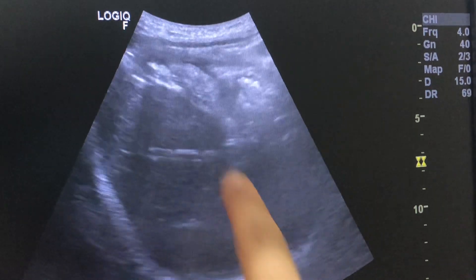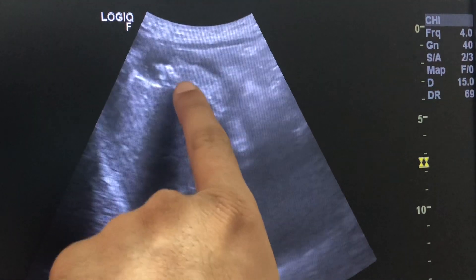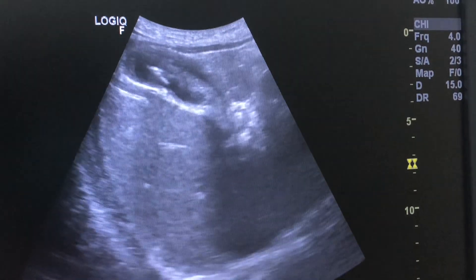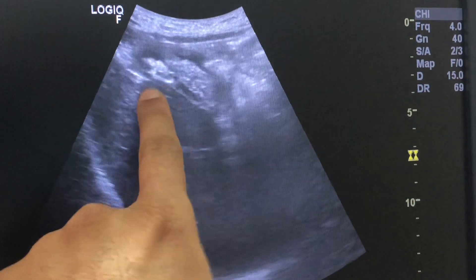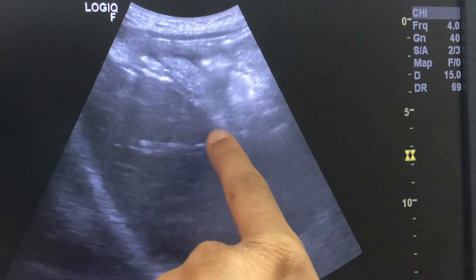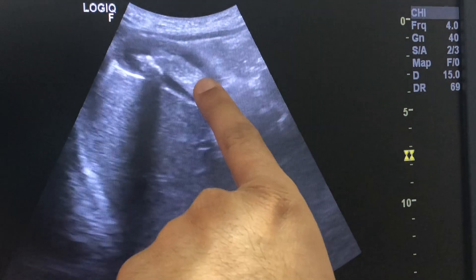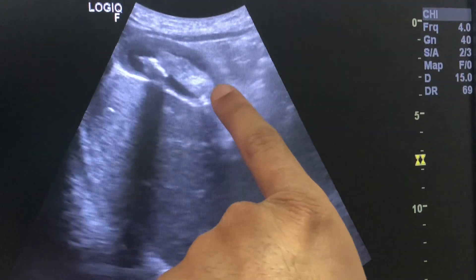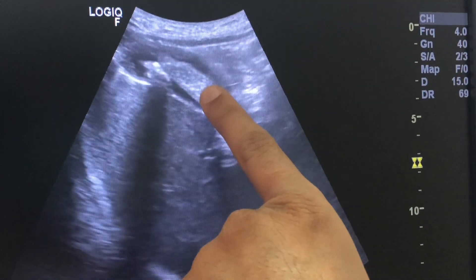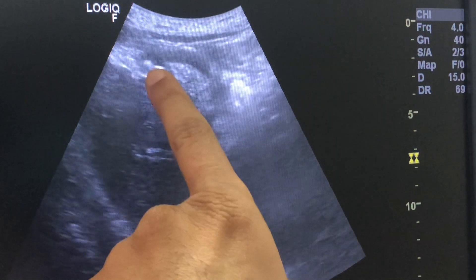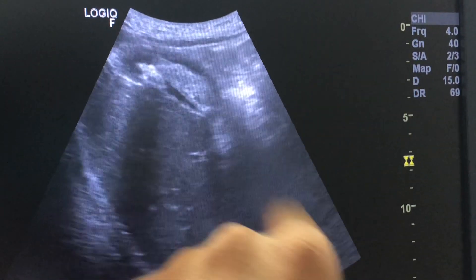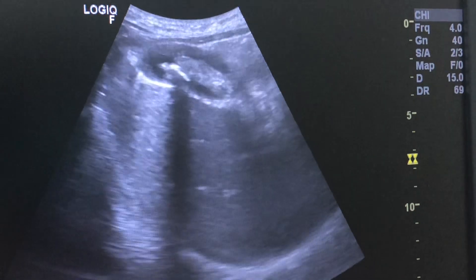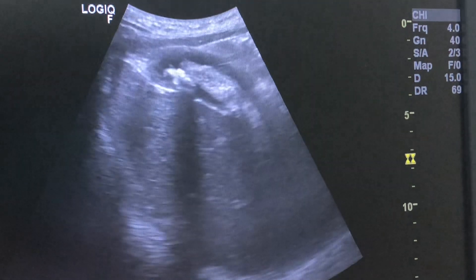There is one calculus over here giving acoustic shadow, and this is the sludge which is not giving acoustic shadow. So this is the way that you can differentiate sludge and calculus in the gallbladder.